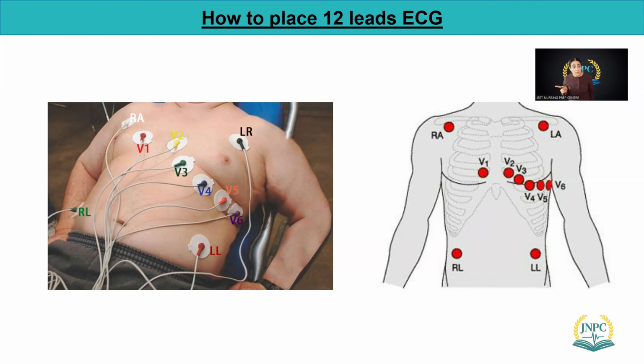If you think you are that person, a slow learner, maybe you need to pause it here. We will post this video on our YouTube channel so that you can watch this again and again if you have any issue. Because I believe that this is what you need to know about all those ECGs which can appear on your NCLEX-RN exam. Other than that, you don't need anything. And I'm 100% sure about that.